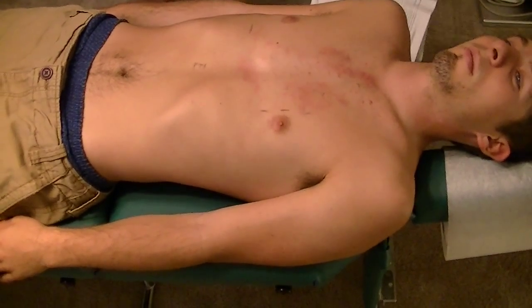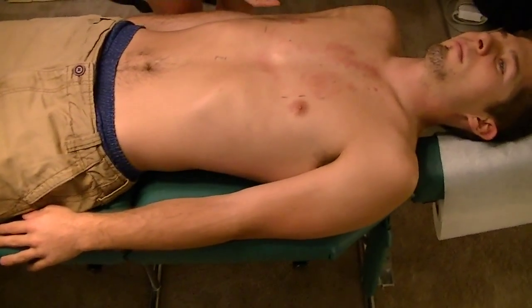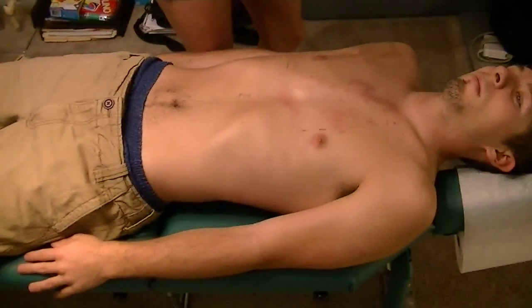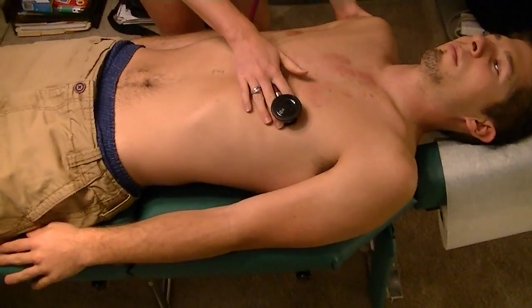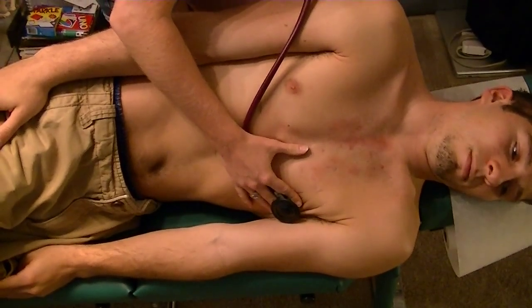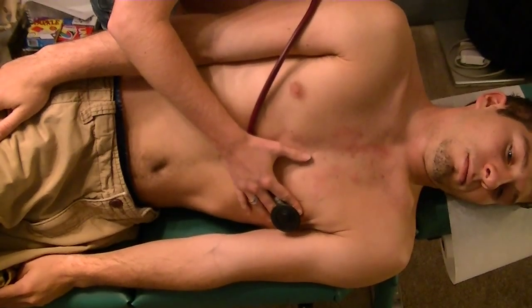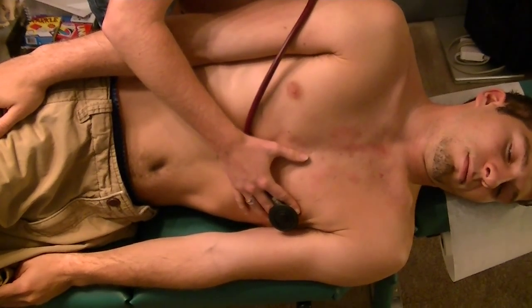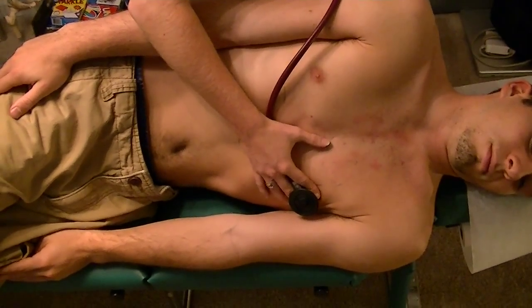So, Jeff, can I have you at a 45-degree angle? First, before you have him at a 45-degree angle, you would place the bell of the stethoscope, so make sure you turn it over. The bell of the stethoscope at the mitral area. Can you go ahead and lean yourself over at a 45-degree angle right here? And you would hold them there in this position. Have them take a deep breath and hold, please. And you're listening for mitral murmurs right here at a 45-degree angle, holding it here at the mitral space. Go ahead and lay it back down.